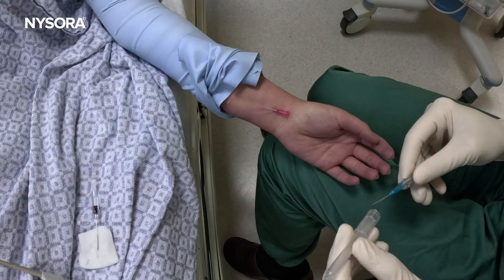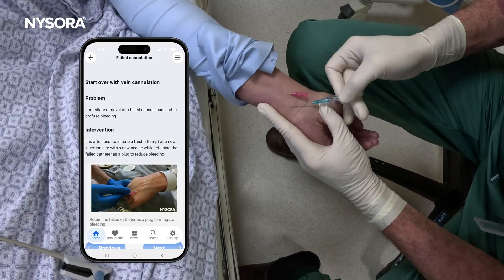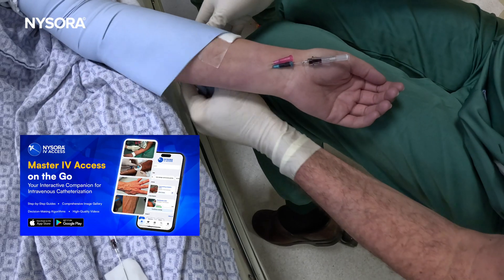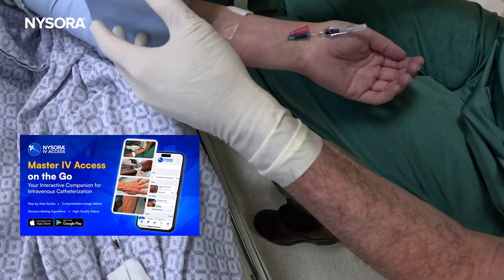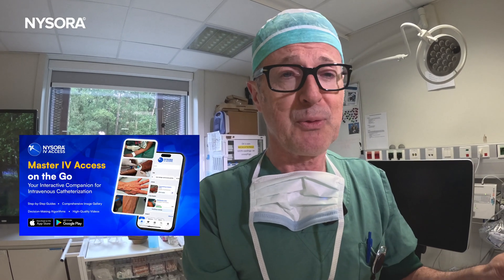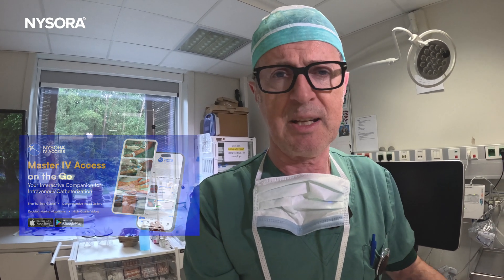And that was it — the failure to accomplish IV access in a difficult IV patient, and what to do after your first attempt fails. Remember, never take the catheter out, because if you do, you're running the risk of creating a hematoma. Therefore, leave the catheter inside to prevent hematoma formation. And never release the tourniquet unless you really have to, because you will lose the valuable time it took for blood to accumulate in the veins to make them more visible and accessible.